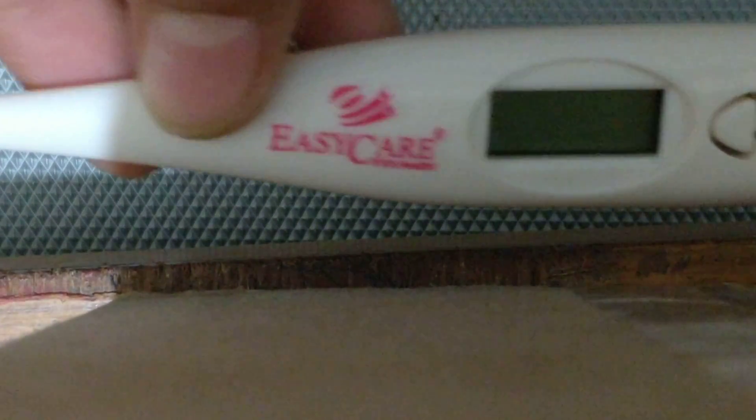So if you see the build quality, it's completely made of plastic with metal over here, and display and this button. This is of EasyCare company and we are going to see what's inside it and how it's working.